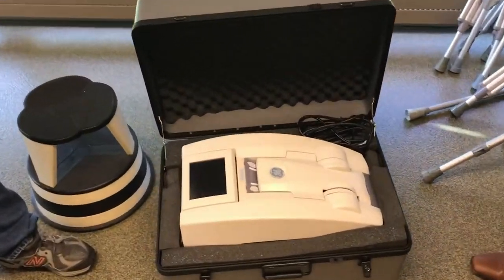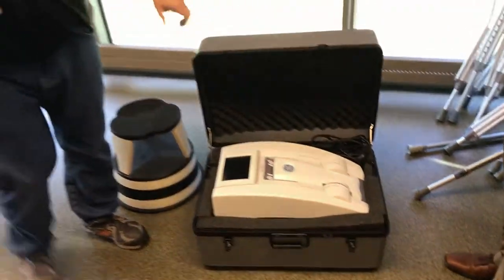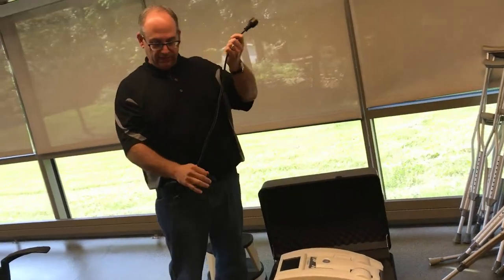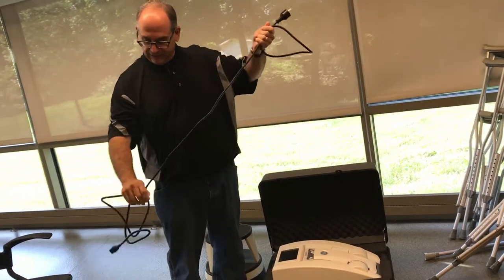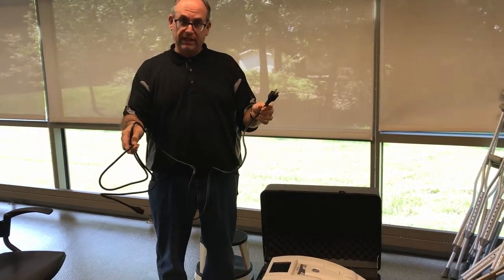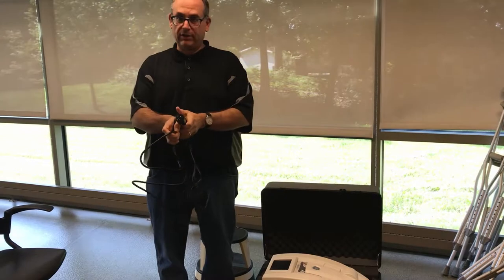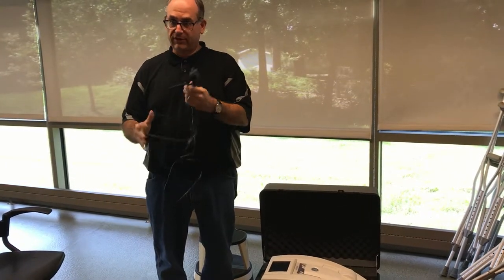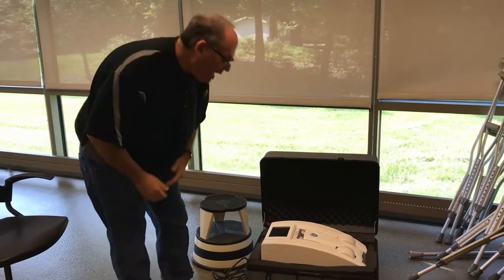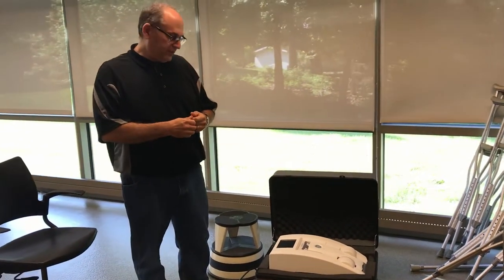There should also be a power cord. One thing to be aware of is how long that power cord is relative to where you're going to run the device. It is fairly long, but we've had times where students needed to bring an extension cord because the outlet was farther than the cord could reach. So definitely have an extension cord with you.